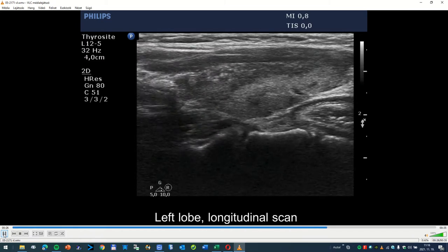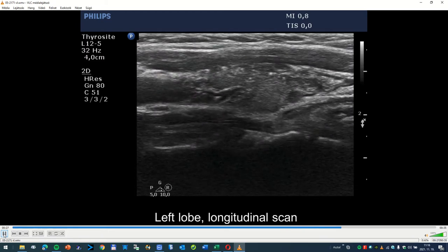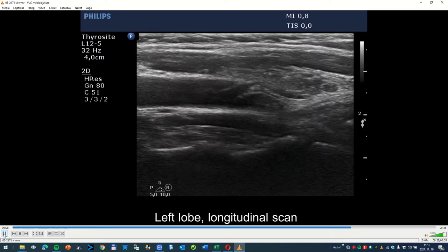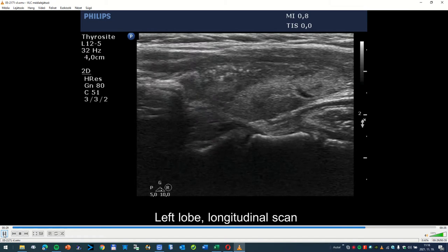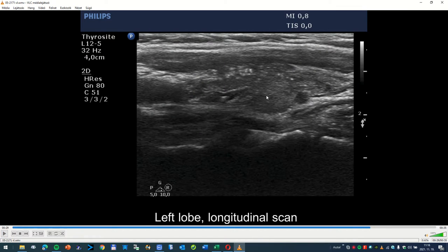So this is quite a rare finding in thyroiditis. Thyroiditis frequently has connective tissue, or proliferative connective tissue, for example here or here, but these granules are much brighter than this line, for example.